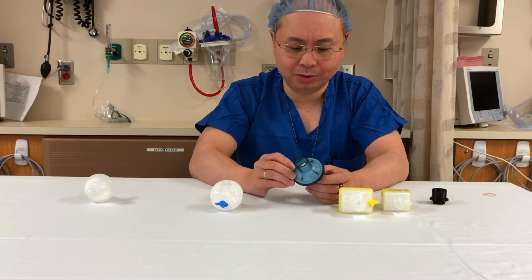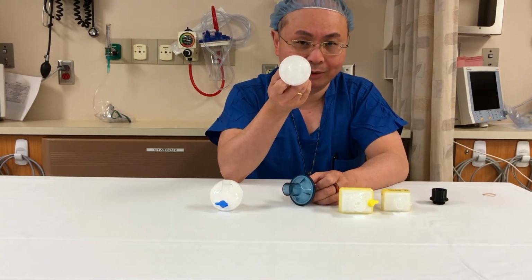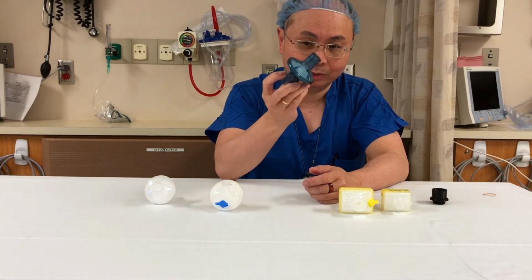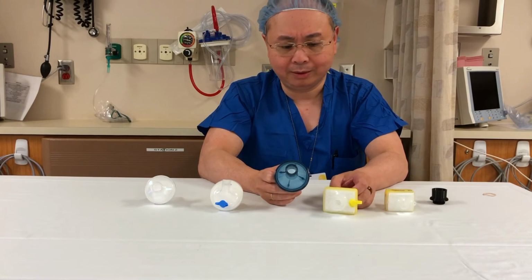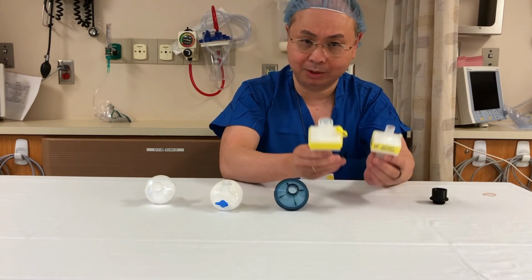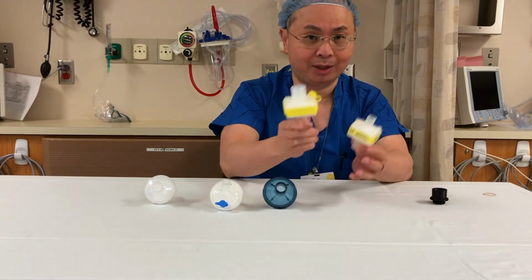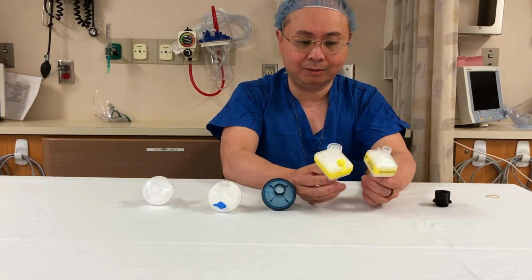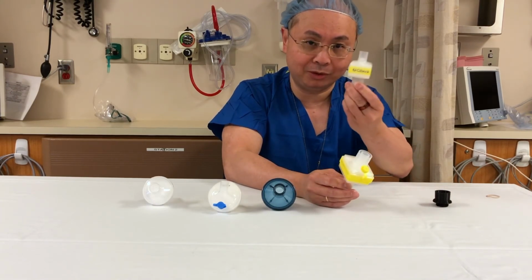Okay, so that gives you your summary of filters. Don't use a cheap one that doesn't have any specifications. Always select one that has full viral reduction capability that has been documented and tested. And if you are forced to use an HMEF, and it's likely that you're going to have HMEFs in your hospital because HMEFs are actually more desirable than plain filters if you're on a ventilator, check their flow resistance characteristics and make sure that the Bunny PAPR can get enough flow for the user with the filters that you have.